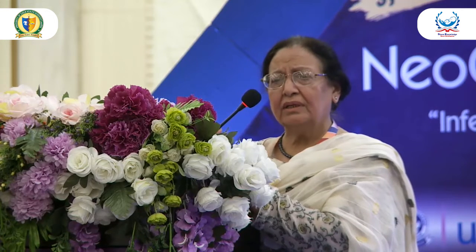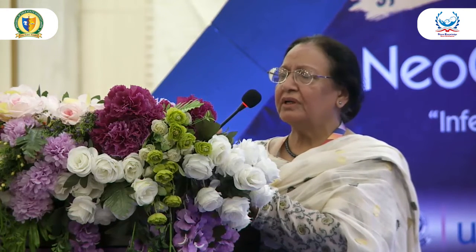The way it has been done, the lecture that was given by Professor Irfan, seeing it, it felt like we wouldn't have to do anything and we will put in all the lines ourselves. It was very nicely discussed. One point he discussed well was how to do it, who are the kids who really need it, that's the question. If a baby doesn't need it, we shouldn't be putting it in. Because peripheral IVs can work, but how long can the peripheral IVs work, unfortunately. Again every third day blood is drawn, every fourth day IVs are placed, unfortunately, and the risk of sepsis increases.